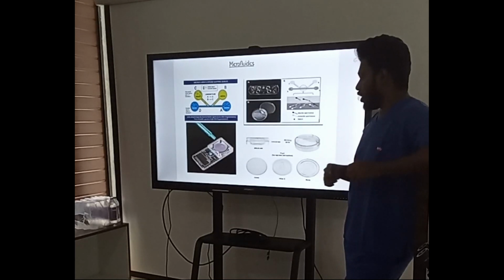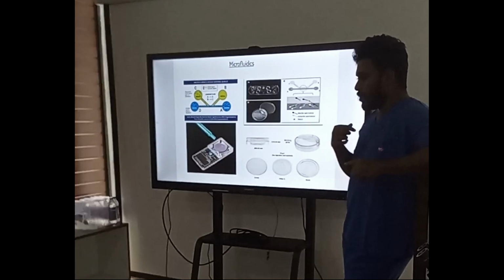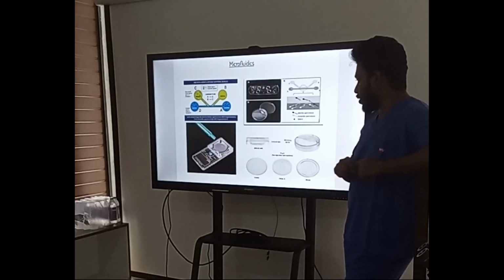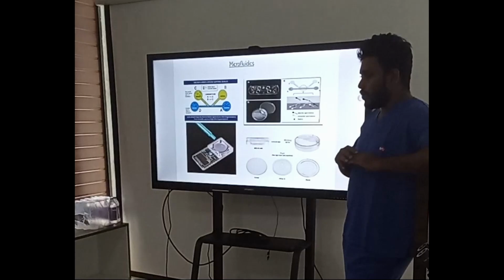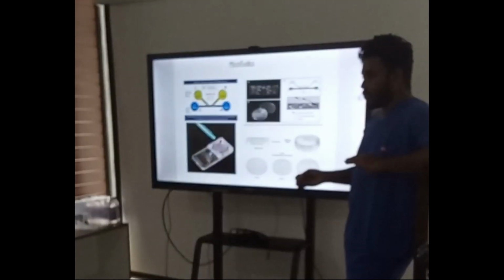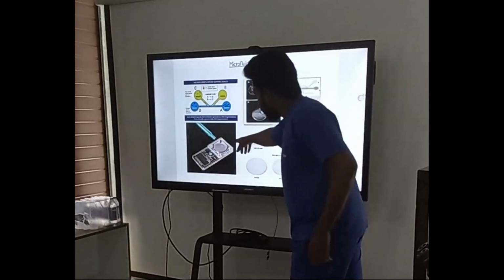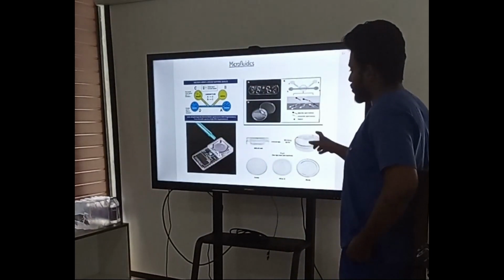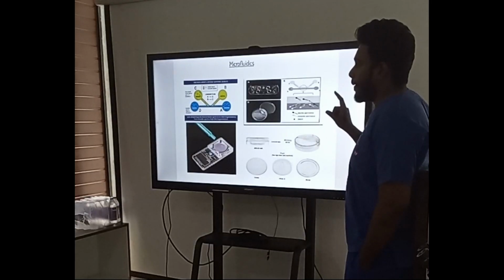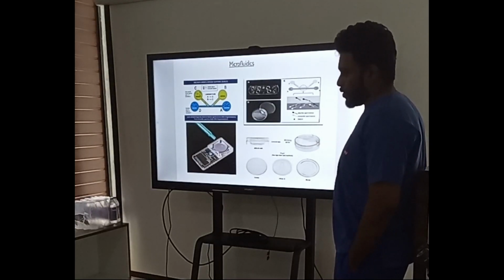Just drop 1 ml of sample above that layer of buffer solution of 1 ml. In between you will have a layer which is sandwiched, where only the normal motile sperm will elute from the bottom to the top, and at the top you will have a collection chamber to collect it. The maximum time limit of this whole process is around 20 to 25 minutes.